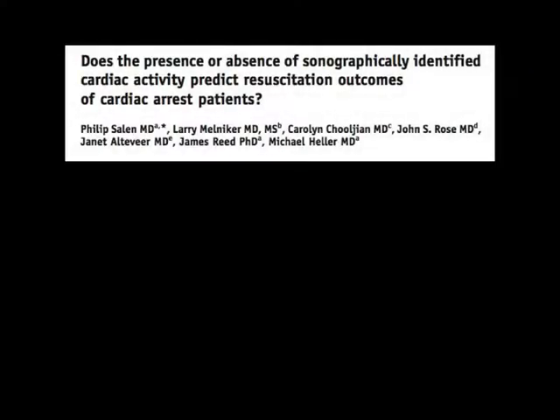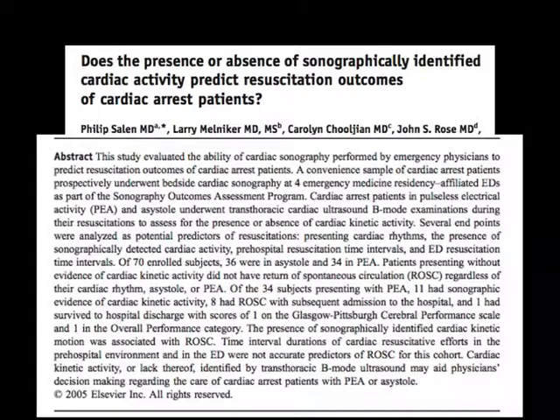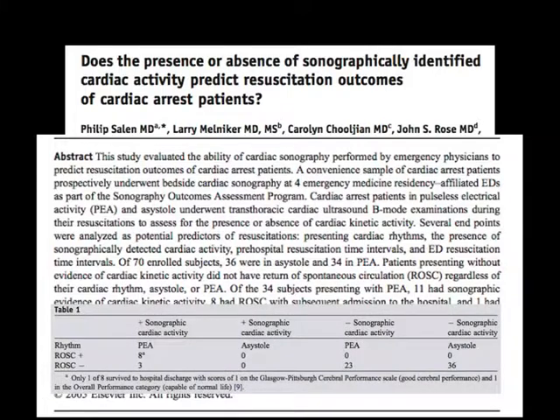And then another study was done by Phil Salen et al., colleagues of mine, John Rose and those guys, who did a similar study, basically the same exact concept, but they looked at if you had no return of sonographic cardiac activity, no matter what your rhythm was, you did not have ROSC. You did not have return of spontaneous circulation in any patient. Not a single one. Again, small numbers, small studies.